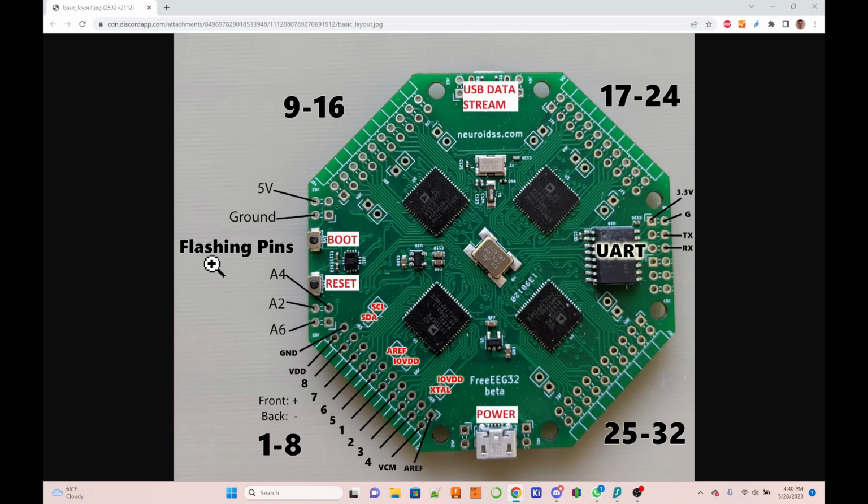So the VCM puts out a voltage. In this case of the FreeEEG32, it is halfway between 0 volt and 3.3 volt. The board itself operates on 3.3 volts. So VCM puts out 1.67 volts. And you connect that to your brain. And if you make your own headset, it is advisable to put that in a very central location. For example, standard neurofeedback headsets have it just below FPZ position. FPZ is in the middle, slightly high up on the forehead.